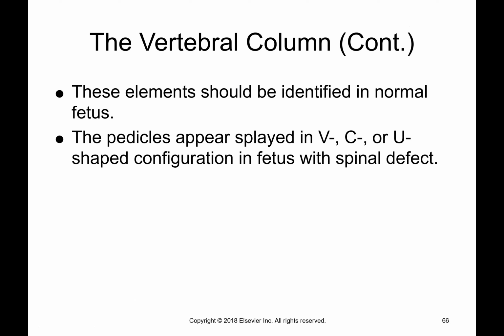These elements should be identified in a normal fetus. These pedicles appear splayed in a U-shaped configuration in a fetus, and it's probably because of a spinal defect.